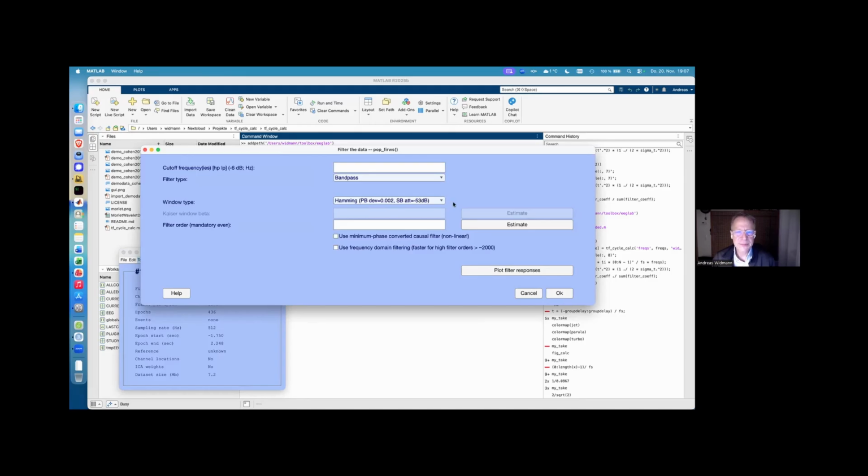The key point now is that we can, let's put a 40 Hertz low pass filter here. No, I wanted to have 48. You should think about how the filter order defines the roll-off here, and we can estimate that. We have math to do that, so you do not have to trust some EEGLAB default heuristic. You can do that yourself.